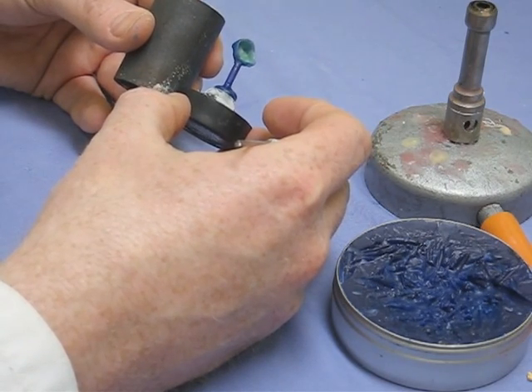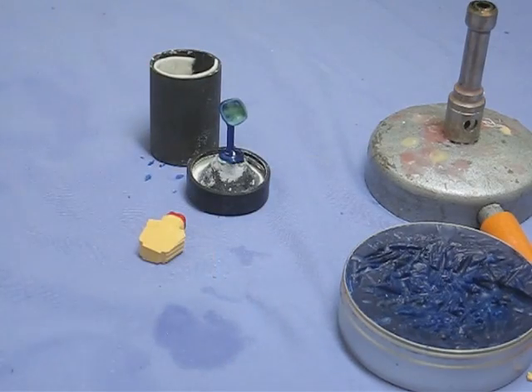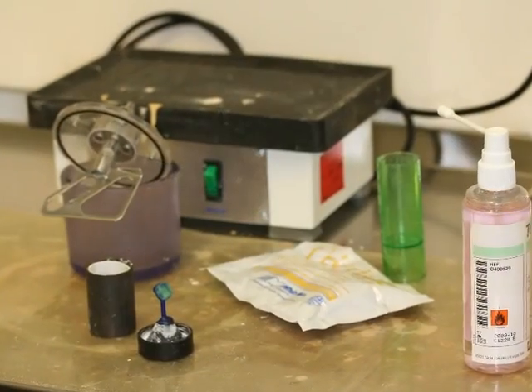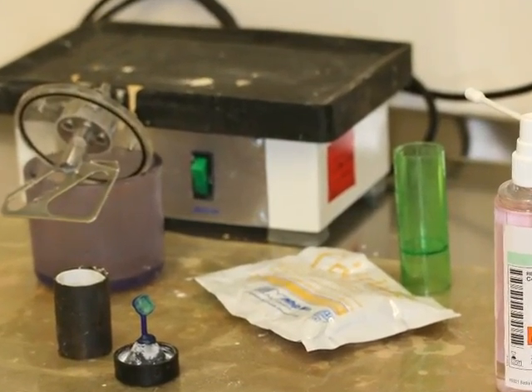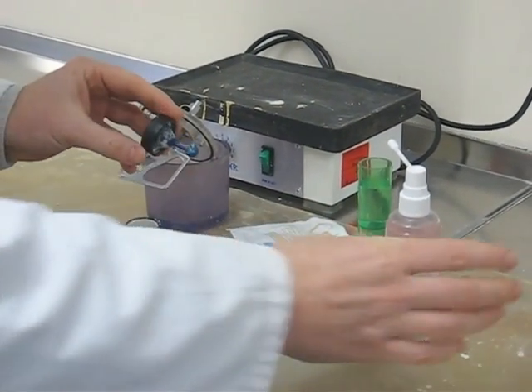So notice the sprues being mounted sort of straight up and the pattern is at an angle so that as the metal shoots through it will just fill it all in the direction of the casting.